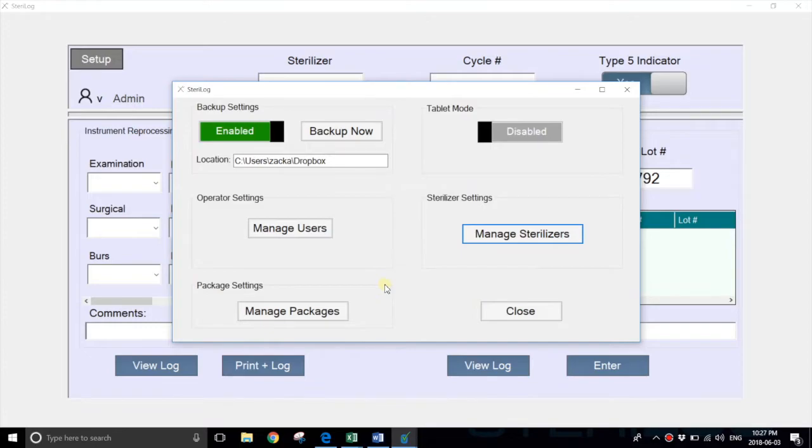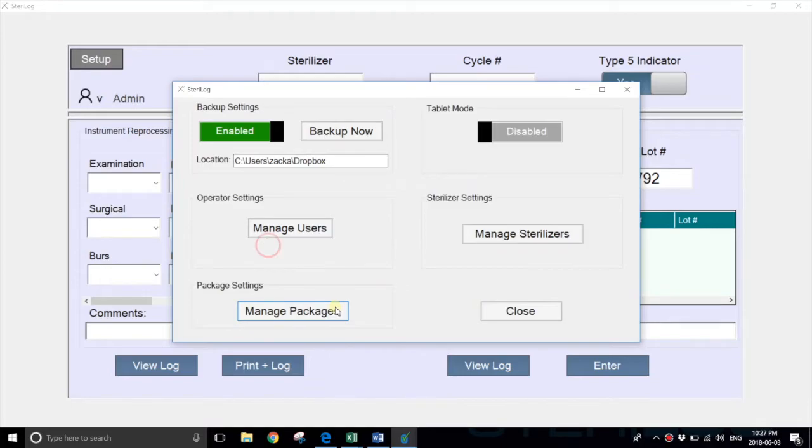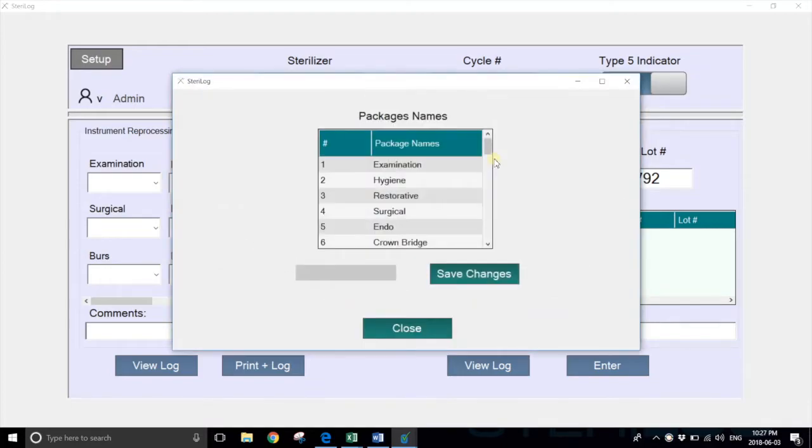Finally, you'll want to customize the names of your packages. These are the instruments that you'll be reprocessing. Select manage packages and you'll see that the system is pre-loaded with defaults like examinations, hygiene, and restorative kits.